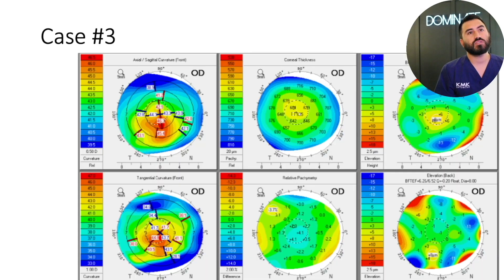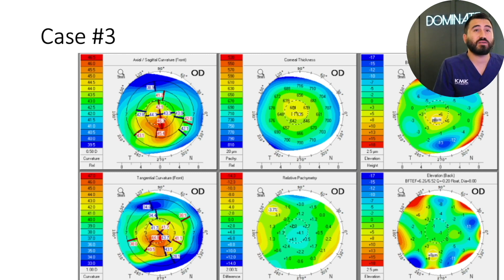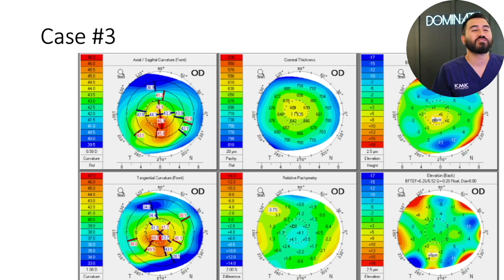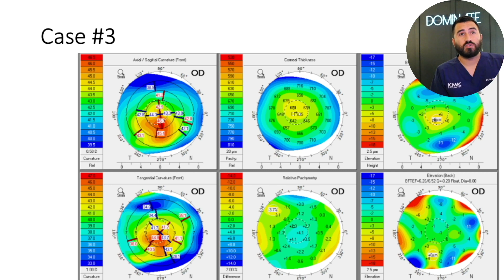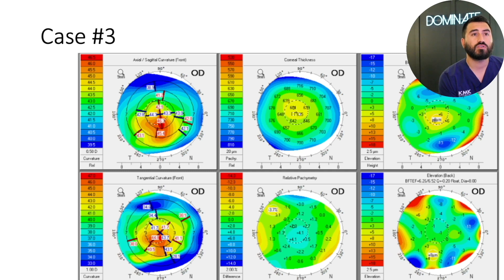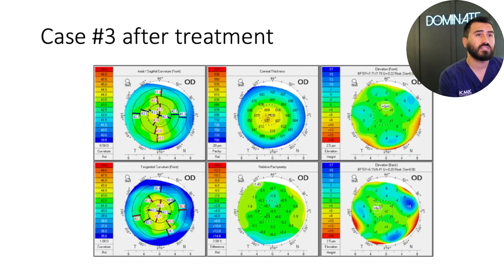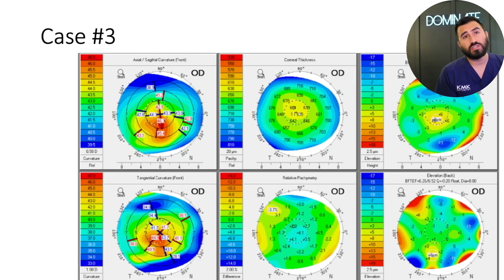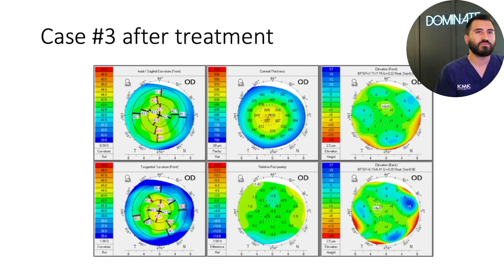I love this one. So here you have inferior steepening — inferior steepening, almost steepening centrally. So you're expecting me to say yes keratoconus, but of course the answer is no. Well, inferior steepening — my differential is keratoconus and keratoconus. So what else could this be? If you look in that bottom right, there's no posterior float. What this is an example of is dry eye. Dry eye can cause inferior steepening, and you see a picture which looks like keratoconus or even post-hyperopic LASIK, and it's just treating the tear film — and boom, our scans get better.